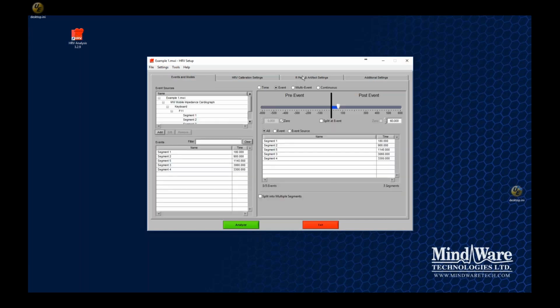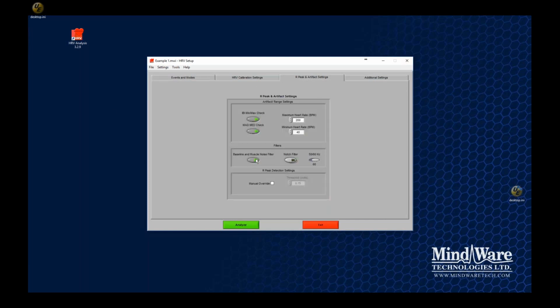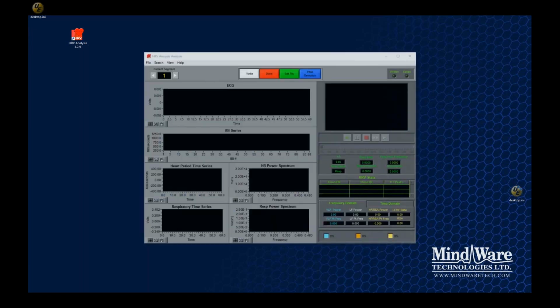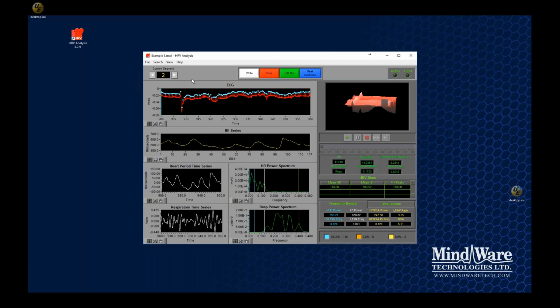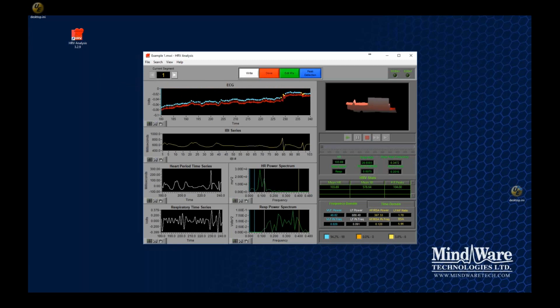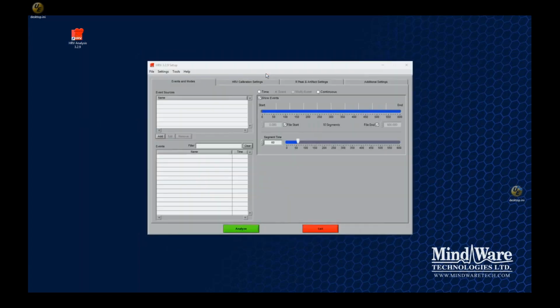So just really quickly, I can show you an example of what this baseline and muscle noise filter is doing. If I just turn it off and click Analyze, and we take a look at this signal, we can see that it's really moving all over the place. It's starting at a lower amplitude, and it has this very low frequency trend that is causing it to approach 0 volts as we go through the segment. We can see this movement as we look through many segments. This is a file that was collected in an ambulatory setting, and it sometimes happens.